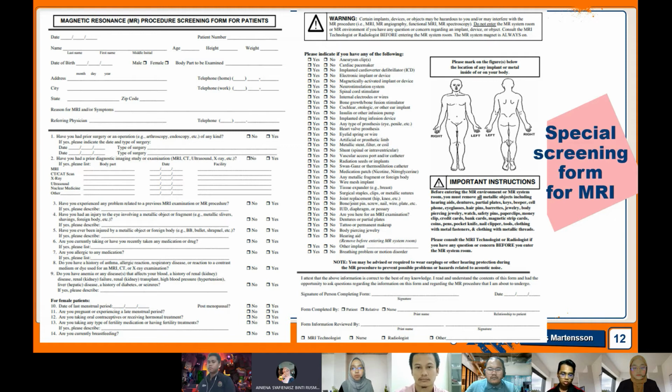The MRI examination is performed in a special room that houses the MR system or scanner. The patient will be escorted into the room by a staff member of the MRI facility and asked to lie down on a comfortably padded table that gently glides you into and out of the scanner. The typical scanner is open on each end or at least two sides.